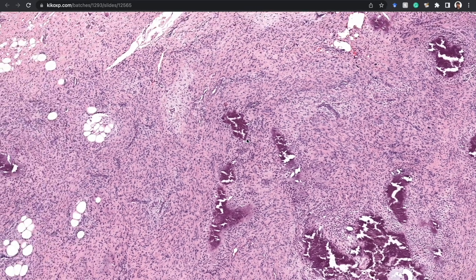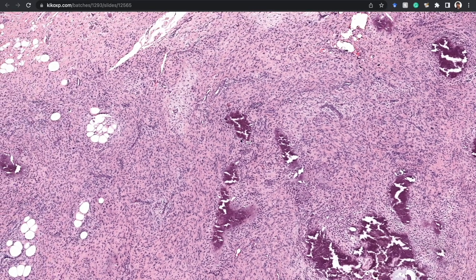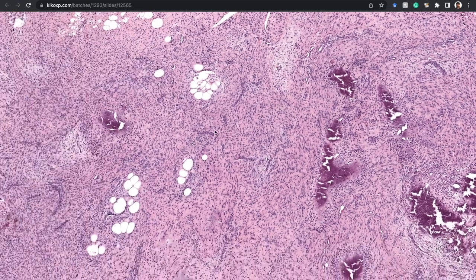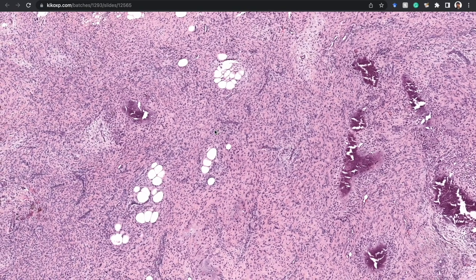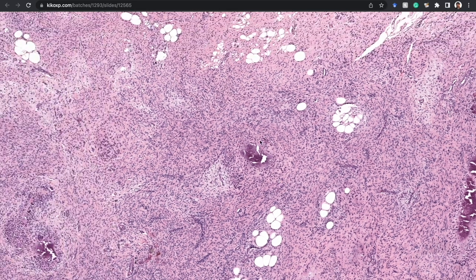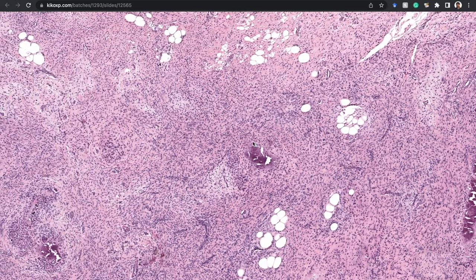On the recurrence you could see little islands like this, and I went back and got the old specimen from an outside institution from years ago, and sure enough, very subtle in the background, there were little areas of this — but it was a really subtle case, and it occurred like 10 or 12 years later.